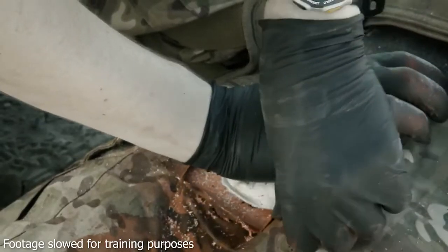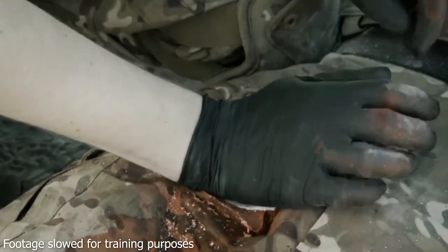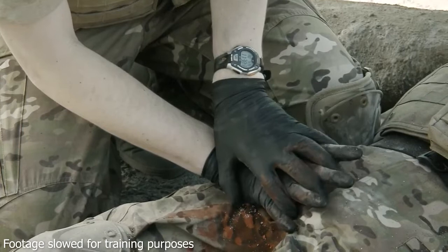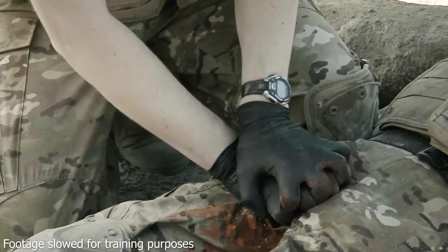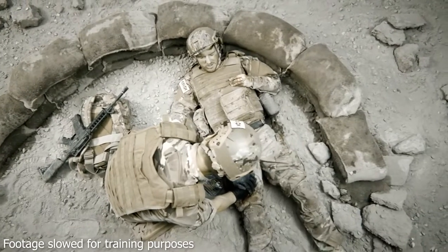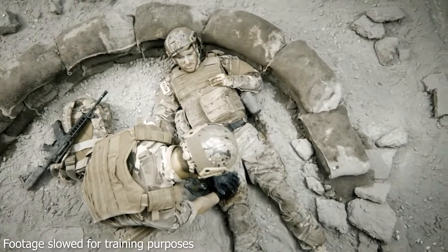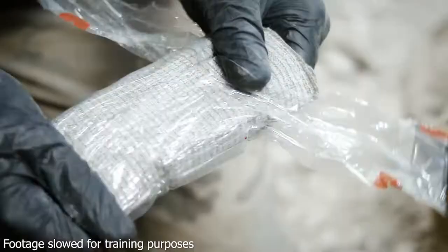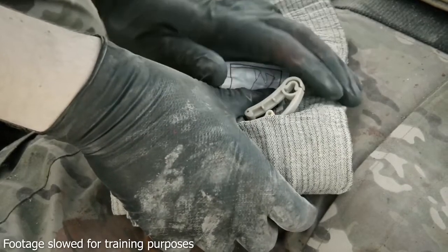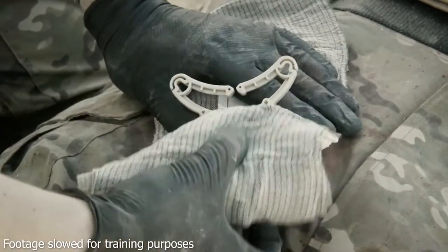Visually check for bleeding around the dressing while still maintaining pressure. If bleeding has not stopped, reapply pressure until bleeding stops. If necessary, cut or tear off excess Celox Gauze before securing the dressing in place. Wrap the wound using bandaging or a pressure dressing to secure and maintain pressure. Discard any remaining Celox Gauze.